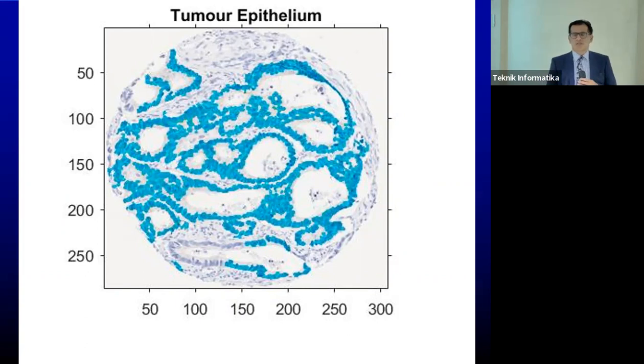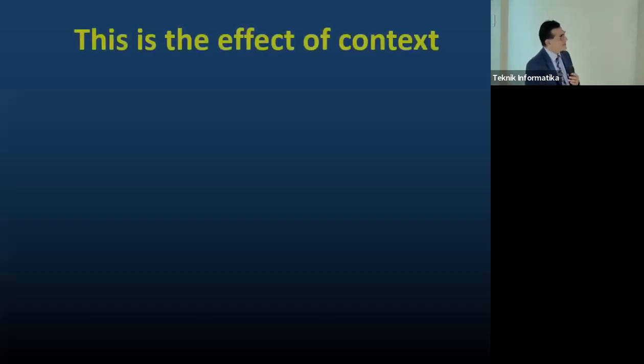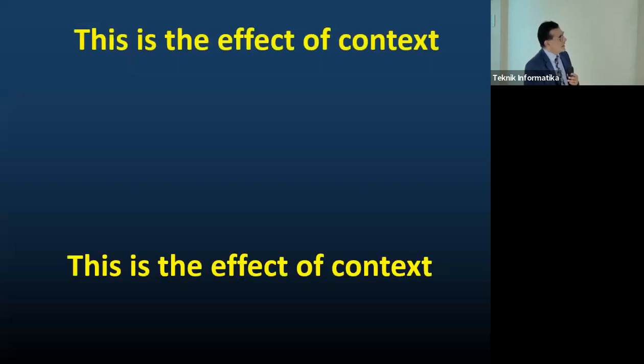But we're just assuming that there is, again, some variation in fixation, which is affecting the quality of the image, which is then confounding the algorithm. So again, variation is going to affect what you see.